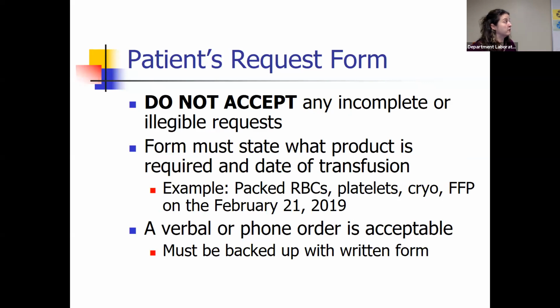Like I mentioned, blood bankers are very specific. And so we do not accept any incomplete or illegible request, and that includes your specimen. So this happened to me, and if you're the tech in charge in blood bank, it is your responsibility to stand up and say, no, I'm not accepting that specimen. You need to redraw it, all right?